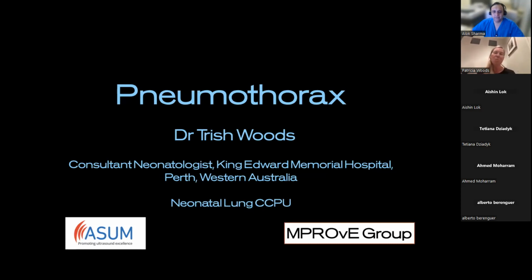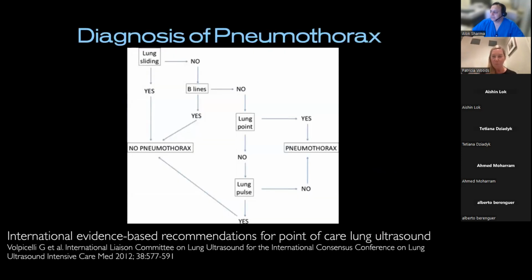So, we thought we'd really talk about things pleural today, to do with pneumothoraces and pleural effusions. And this is one of my favorite topics when we're using point of care lung ultrasound in neonatal intensive care medicine. We'll go back to the basics.